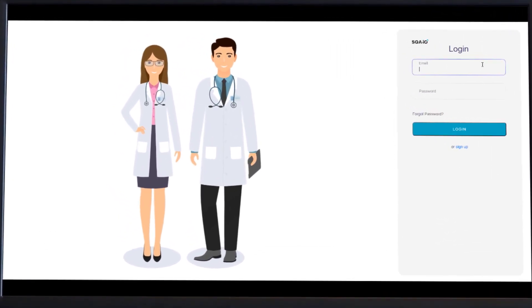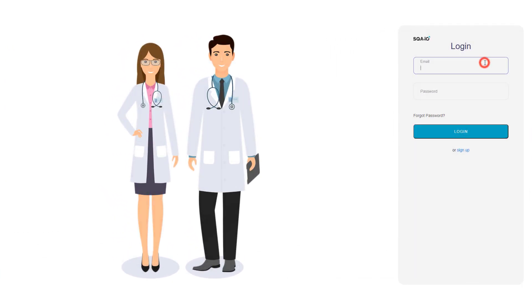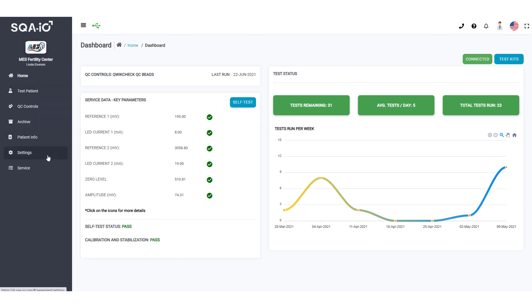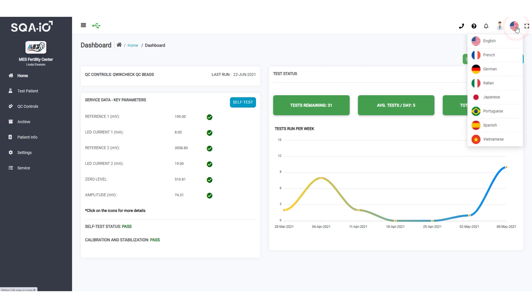Next, log in to the SQA-IO interface using your account email and password. From the SQA-IO dashboard, you can navigate to all features of the SQA-IO. It will always be available for you to use. Select your preferred language from the drop-down list.